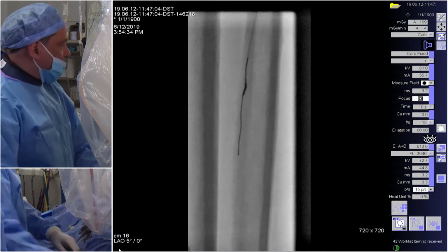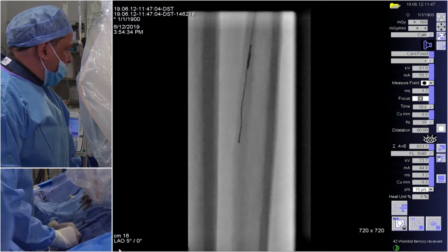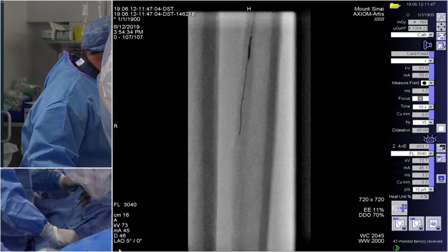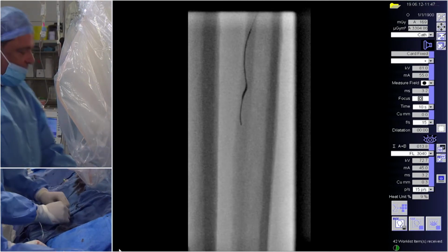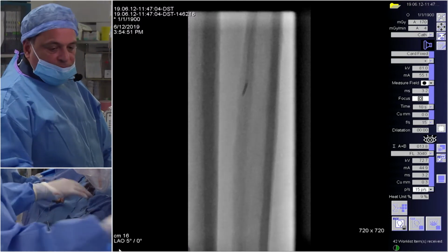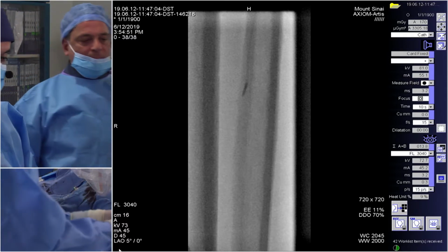That's my opinion. Okay. What about on the previous case that Andre was doing, where he was having a tough time with that wire? Obviously, Andre's very skilled, and he has an armamentarium of different wires. But do you think a reentry catheter would have helped there? You're still going to be using it through a tibial access, so small sheaths. Yeah, it better be small. It would have to be 3 French, something like that. And then you're also going back into the trifurcation. If you remember Andre's case, I'm not sure I like re-entering at the trifurcation.